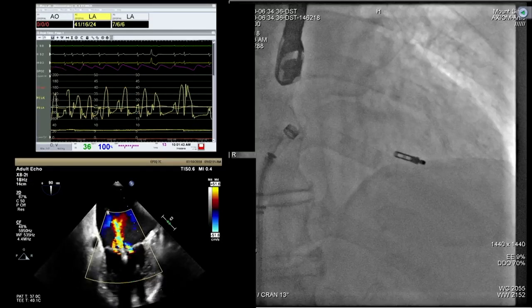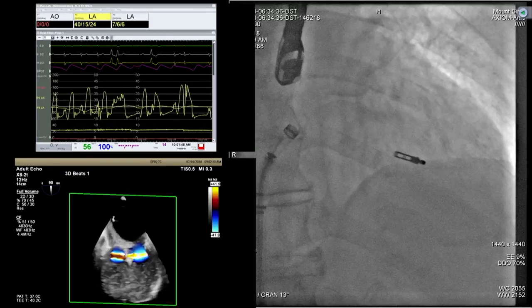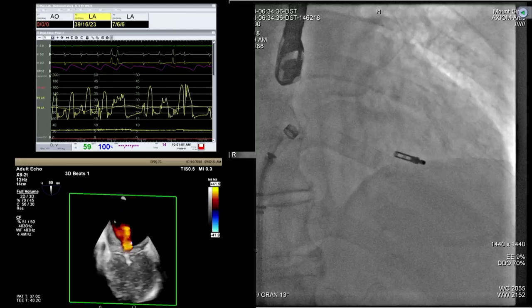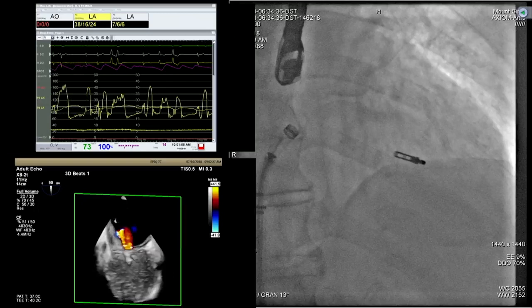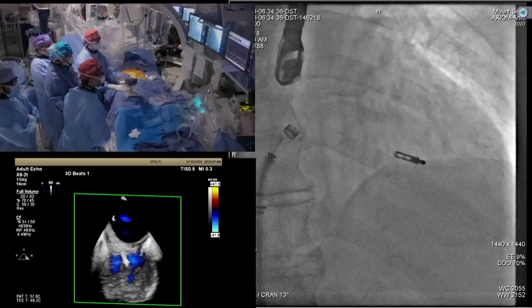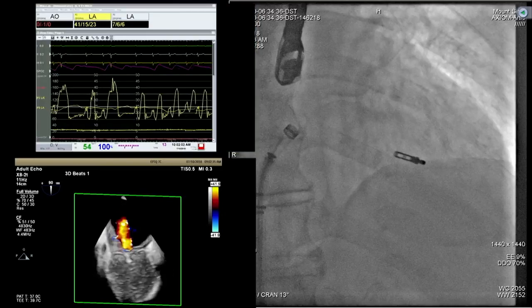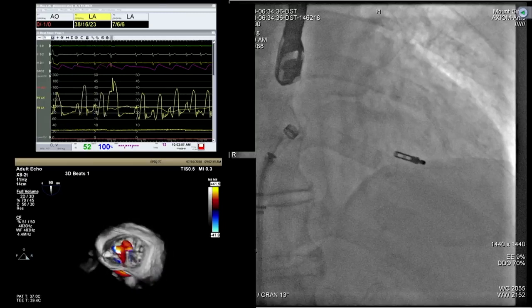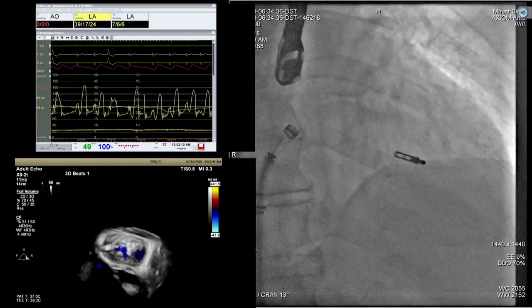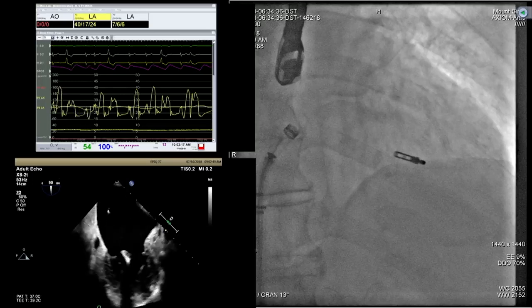So we are putting a second clip, where will it be? Lateral, right? We have a little bit of medial MR left, but lateral is more. And what is the total degree of MR? Earlier it was 4+. How much is it now? It's a good model. 2+. 2.5+. No, 2+. Okay, so this actually is a nice one to show. This more lateral. You see that? 3D was nice. Okay, is the second clip ready?